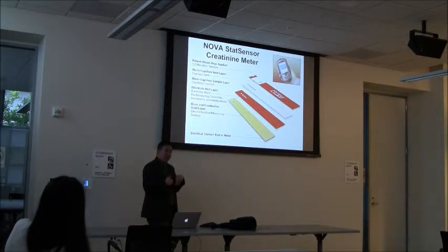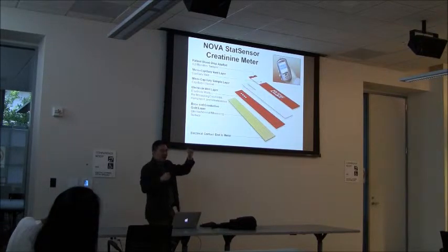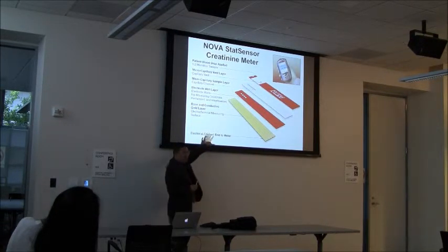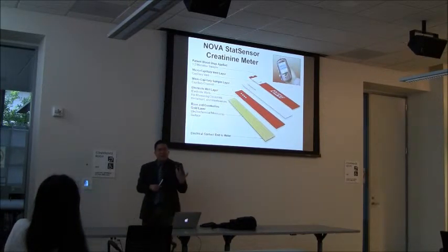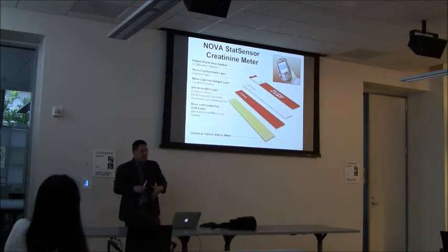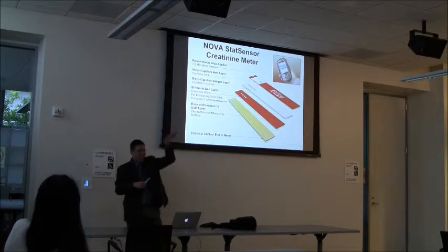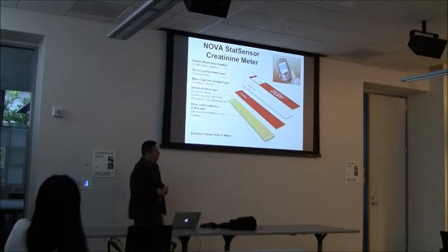What we use for our gold standard for, say, glucose and creatinine in the hospital is actually plasma. We remove all the red blood cells and test it directly from the plasma. These devices test directly from blood, unspun blood. Okay? So that's where we can have some of those inaccurate measurements. So for glucose, when diabetics need insulin, if you read artificially high, you may give them too much insulin, and they may drop too low in their glucose and die from that.